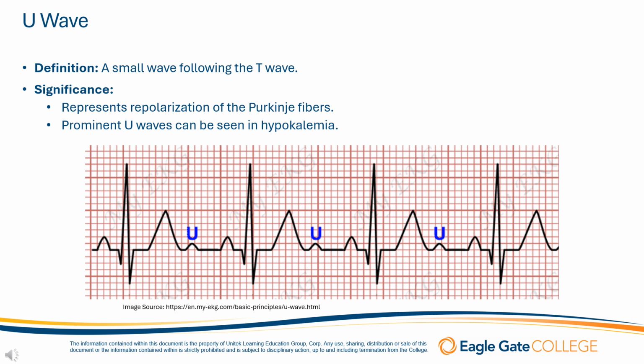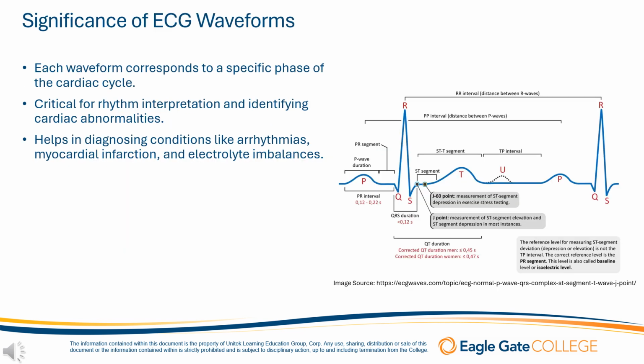And continuous ECG monitoring is essential for patients who have noticeable U wave changes, especially those at risk of developing severe arrhythmias. Follow-up ECGs can help to track the effectiveness of treatment and ensure the stability of the patient's cardiac conduction. So let's look at the ECG waveforms all together one more time and review what's going on.